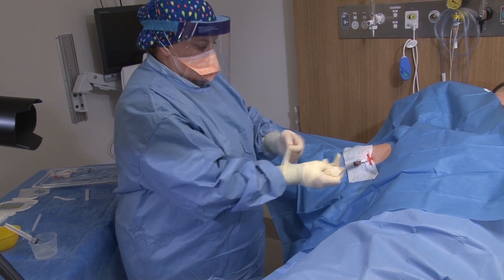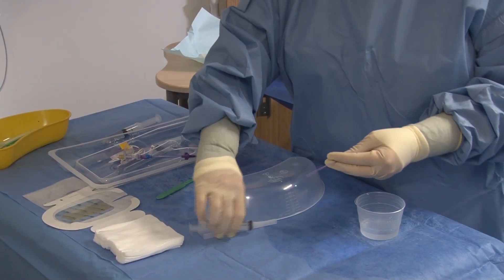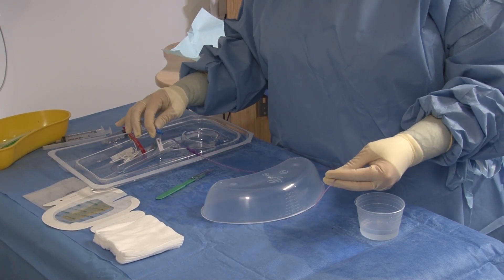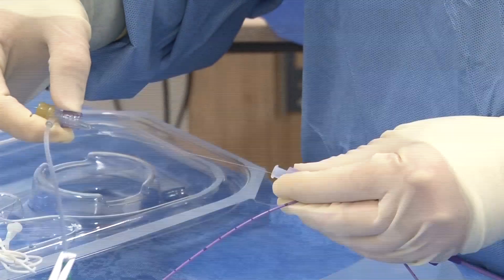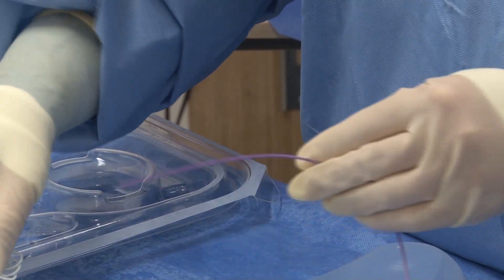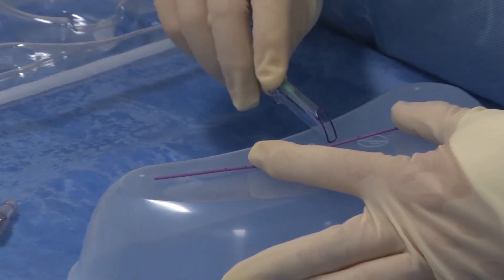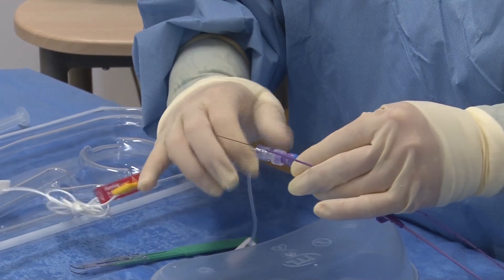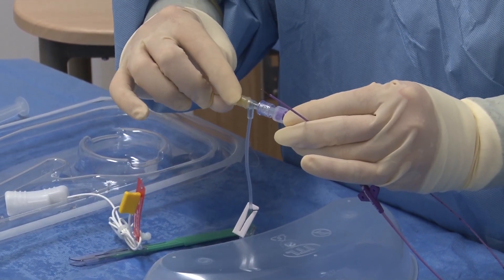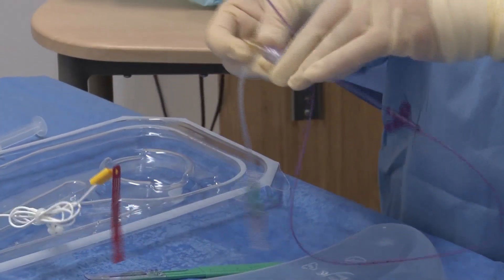Some proceduralists may choose to remove an outer pair of sterile gloves to reduce the risk of contaminating the sterile PICC. To avoid excessive external PICC length, which can be difficult to dress and maintain, consideration should be given to trimming the PICC to the pre-measured length; the PICC's design features and instructions for use will dictate if this is possible. Ensure the stiffening wire is pulled back sufficiently prior to cutting the PICC to avoid cutting the wire. Reinsert the wire so that it correlates with the new length of the PICC. The inserter kinks the wire so that any movement of the wire can be detected later. Prime the PICC with saline.